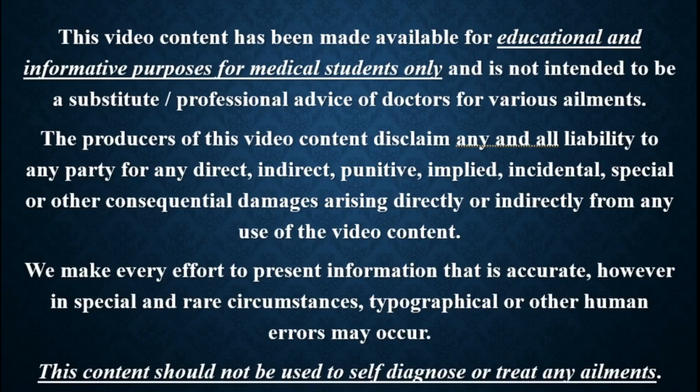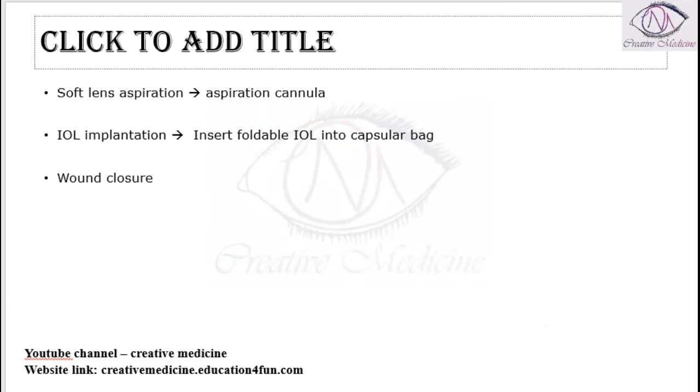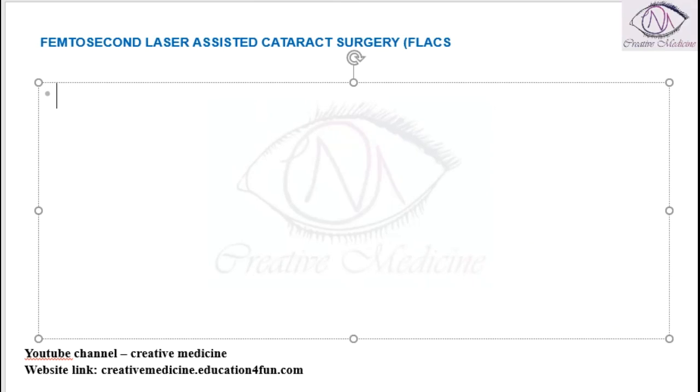In this lecture, we will learn about femtolaser assisted surgery, also called FLACS. In femtolaser assisted surgery, we use the femtolaser, which has a wavelength of around 1053 nanometers.